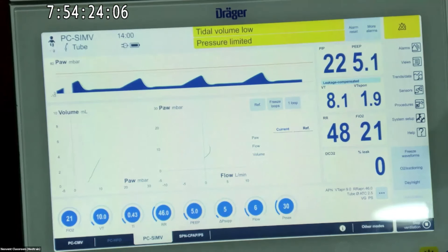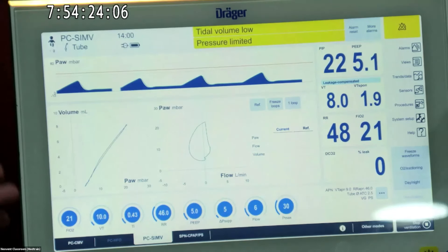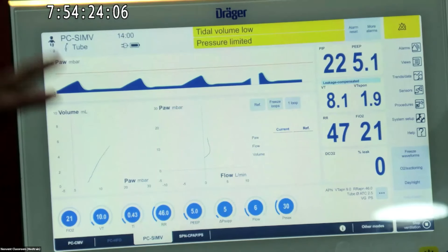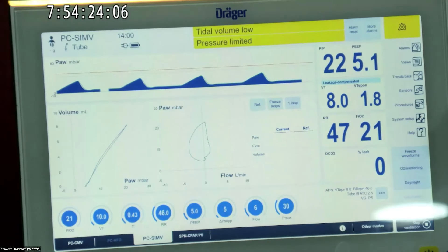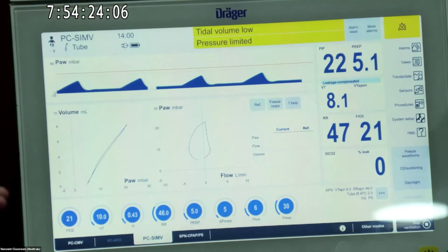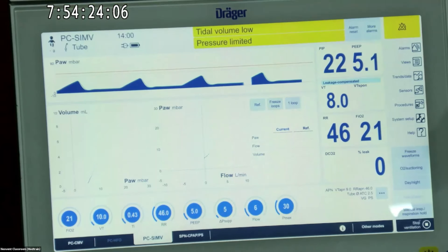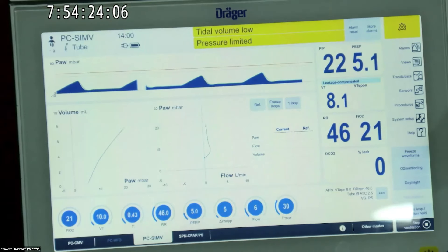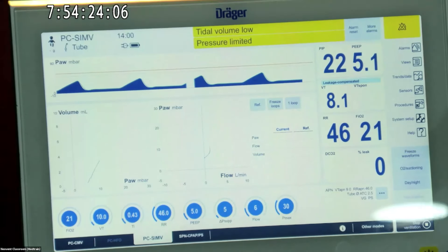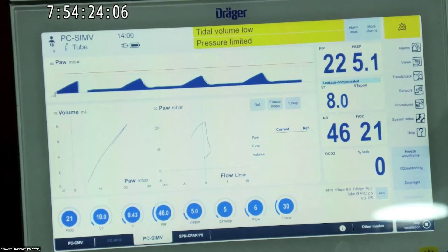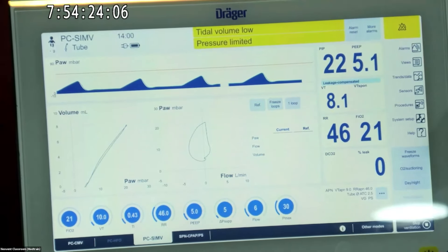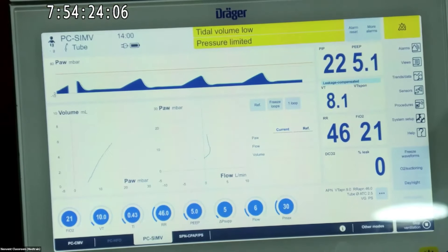Up to 50 percent leak you can correct with VG — don't use VG if leak is more than 50 percent on Dräger; other ventilators usually allow 40-50 percent. Make sure ATC is on if you have more than 25-30 percent leak, so that the pressure delivery will be appropriate to what you set. Other ventilators may not have this leak compensation feature — check with the manufacturer — as this is unique to this ventilator.